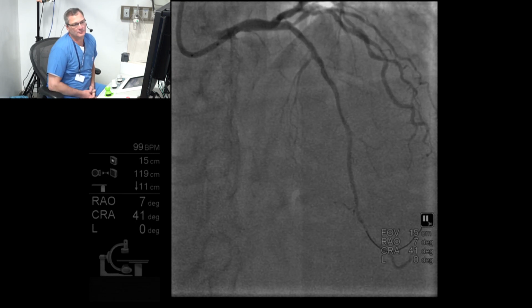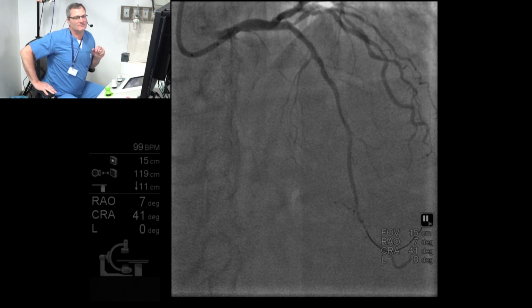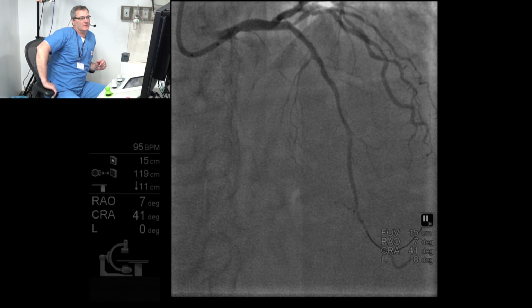You know, Tejas's point earlier was on these long lesions, think about 2 shorter stents. We don't have any side branches to worry about. Let's go 28. Yep, we'll go 28, and then we'll need another bigger one approximately. 38 may give you heartburn. Yeah, no pushing it in. Yep. No, I'm teachable.